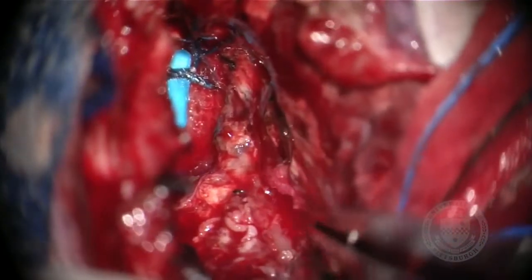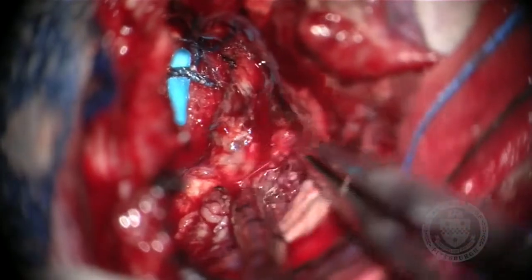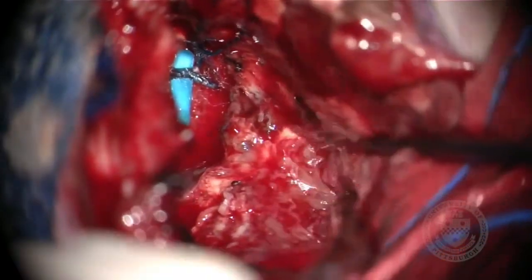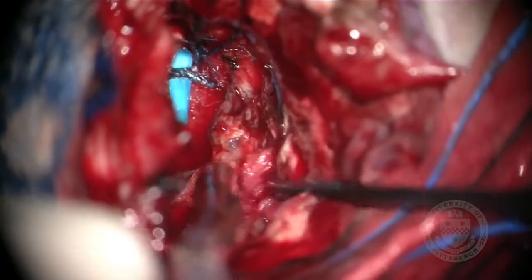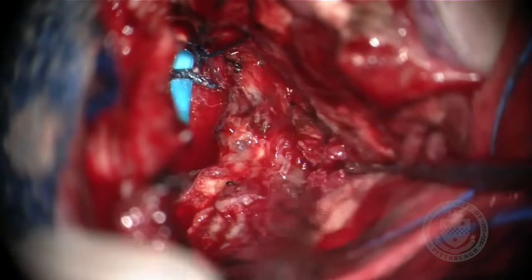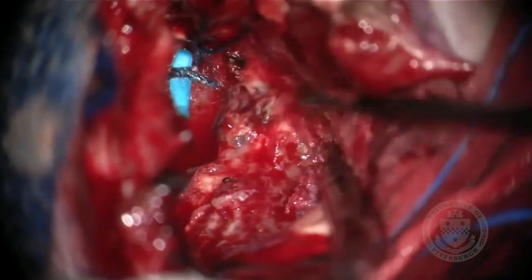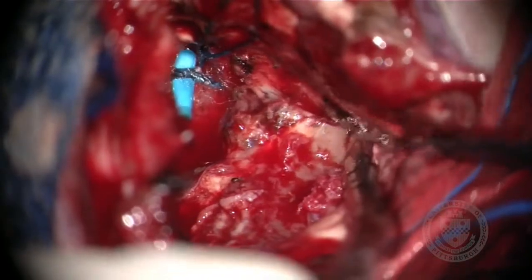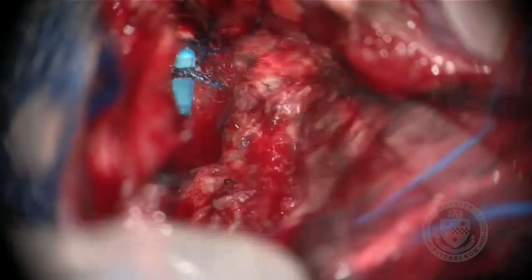Here we start dissecting the tumor away from the superficial white matter of the lateral aspect of the temporal lobe. We find here the choroid plexus, and this is the key landmark for our operation. We want to keep the choroid plexus with the brain and separate the tumor away from the choroid plexus.